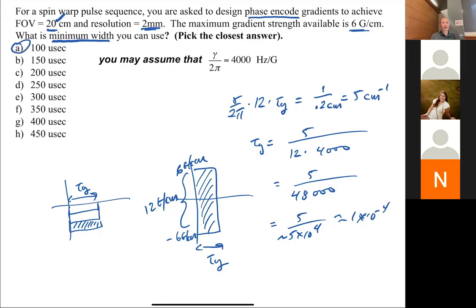All right. So there again, you're given a design constraint, and you're trying to get a certain maximum area, and so that determines what's the minimum width you can have, temporal width. All right. So I think this is sort of the level of complexity of what you'll need to do for the homeworks. It's nothing more than what's the area.